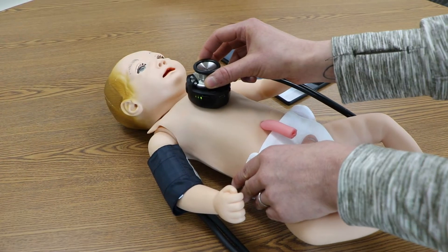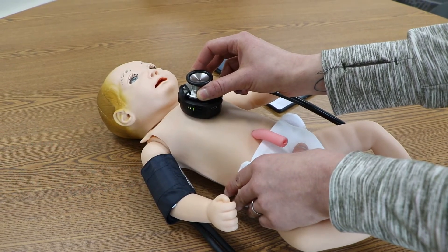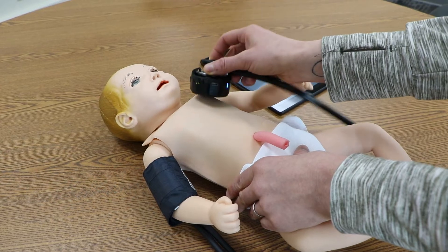Additionally, the included reality scope connects to any stethoscope to let students hear sounds only when placed over a corresponding auscultation site.